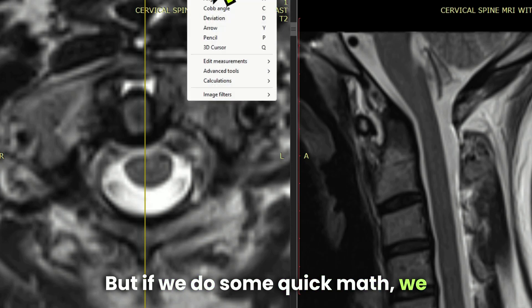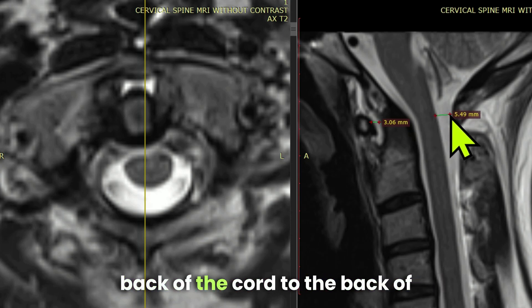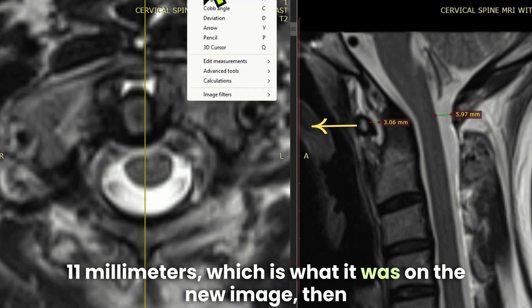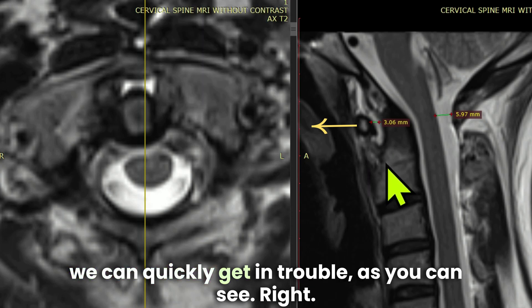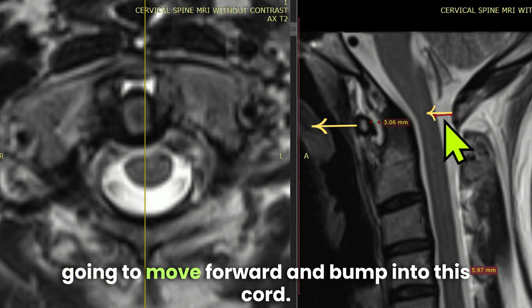If we do some quick math, we can see why this is a concern. This distance here is only about three millimeters, and the distance from the back of the cord to the back of the atlas is about six millimeters. The problem is that if this three millimeters grows to 11 millimeters — which is what it was on the new image — we can quickly get in trouble. Basically, the back of the atlas is going to move forward and bump into the cord. There's just not enough room.